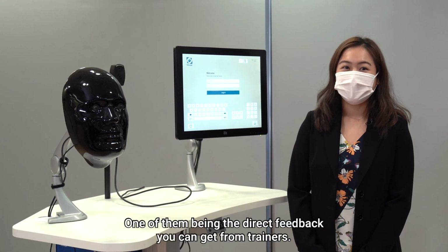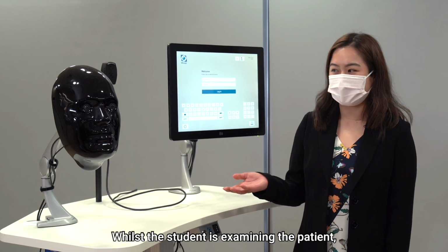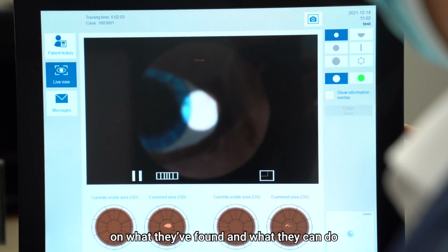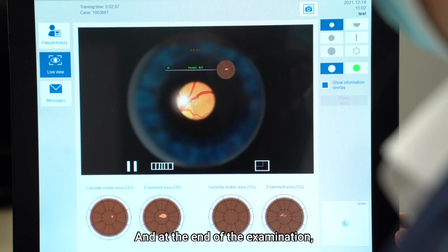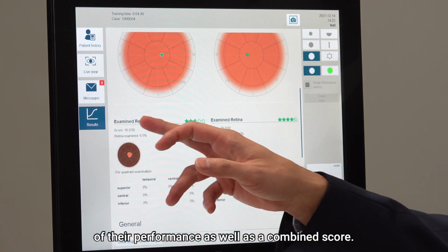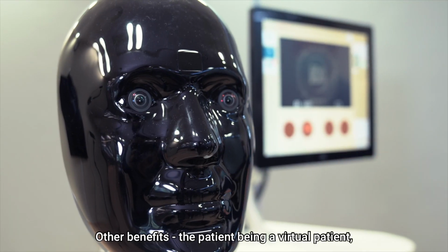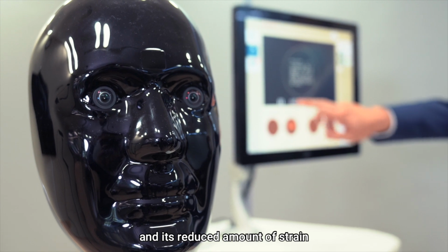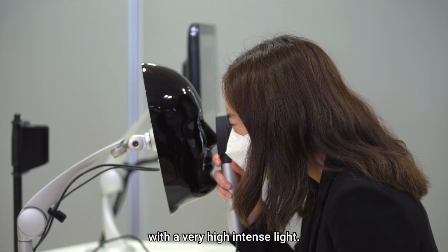One of them being the direct feedback you can get from trainers. Whilst the student is examining the patient, the trainer can give them guidance and tips on what they've found and what they can do to find things that they've missed. And at the end of the examination, they can also receive a very comprehensive evaluation of their performance as well as a combined score. Other benefits, the patient being a virtual patient and its reduced amount of strain that is usually inflicted on a normal patient with a very high intense light.